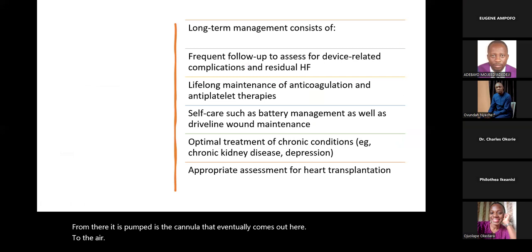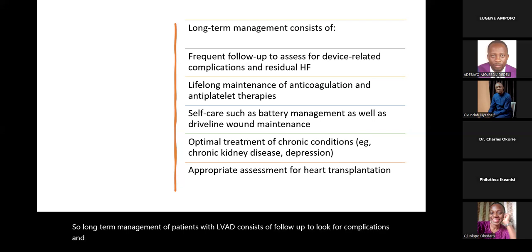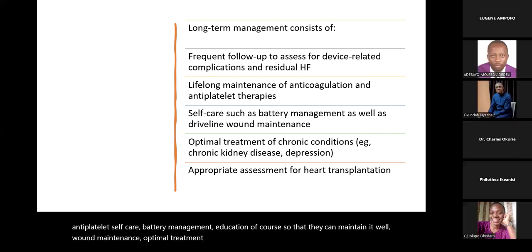So long-term management of patients with LVAD consists of follow-up to look for complications and heart failure symptoms, maintenance of lifelong anticoagulation and antiplatelet therapy, self-care, battery management, education, of course, so that they can maintain it well, wound maintenance, optimal treatment of chronic conditions such as CKD, lung disease, depression, all of them. Then, of course, appropriate assessment for heart transplantation.